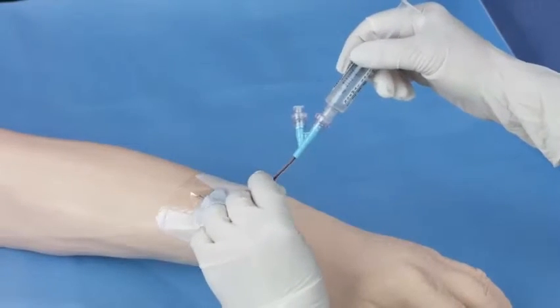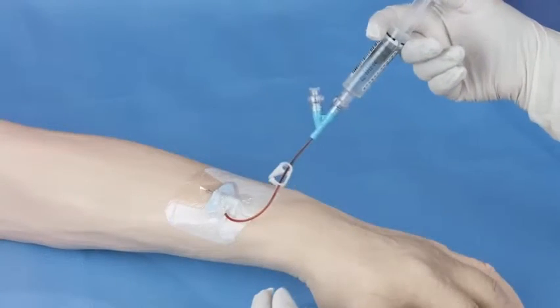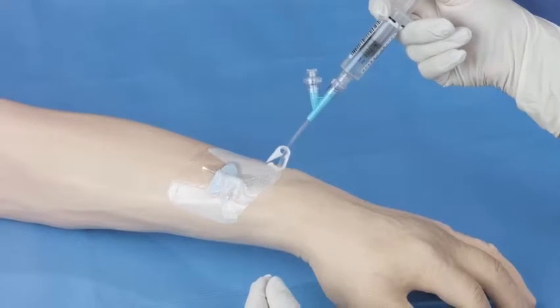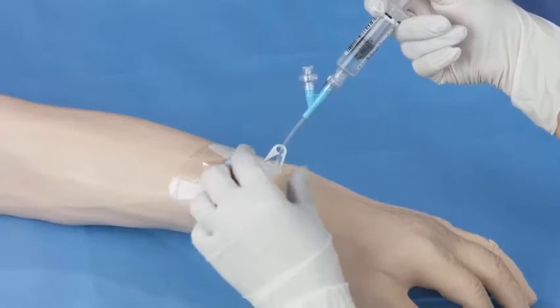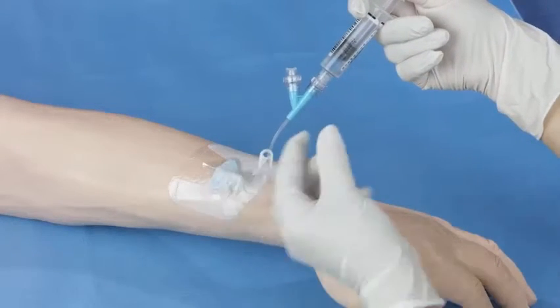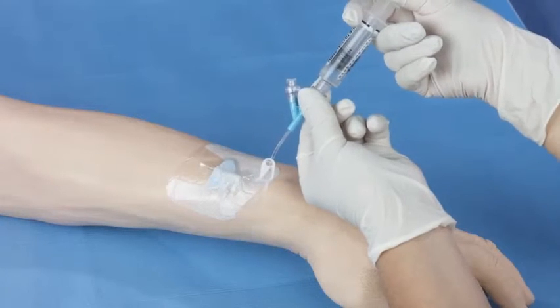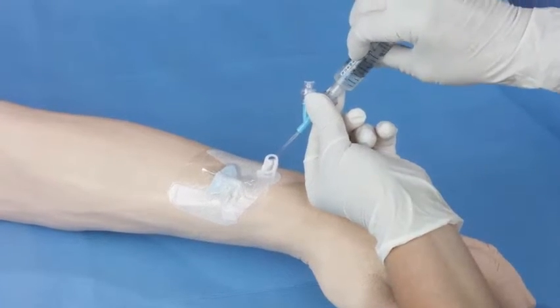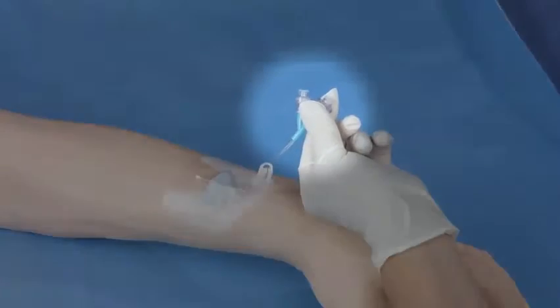Release the clamp and flush until clear. A push-pause technique might be considered. To minimize the reflux of blood into the catheter tip, activate the clamp in accordance with the needle-free connector directions for use. To prevent accidental removal of the needle-free connector, hold onto it while removing the syringe.